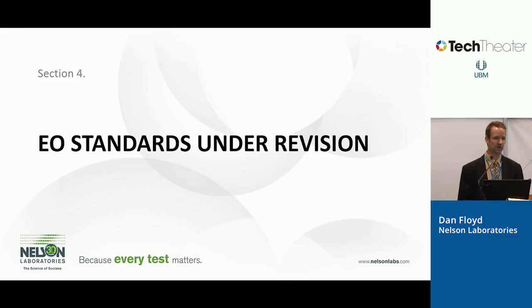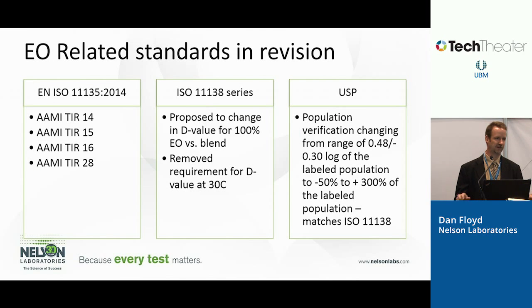A lot of you have probably heard in the news, a big issue that's going on right now. The last one is a list of all these EO standards that are changing. We mentioned ISO 11135 changed. So all these related AAMI TIRs are also being revised as we speak. The revision process can take 1 to 2 years. It's a long, complicated process to get these things done.